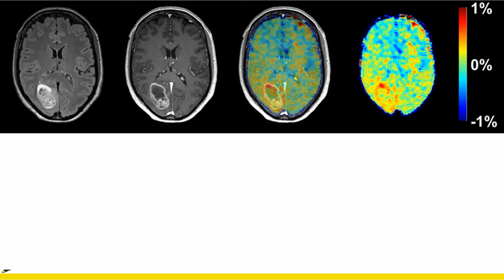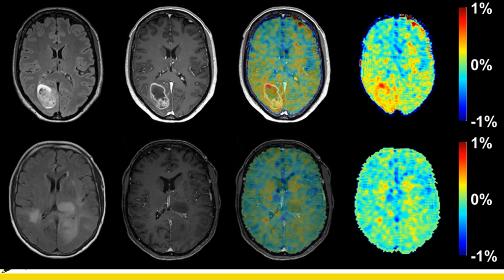And I also brought results from another patient we measured where we did not see any gadolinium enhancement, and we also did not obtain any significant positive DGE contrast.